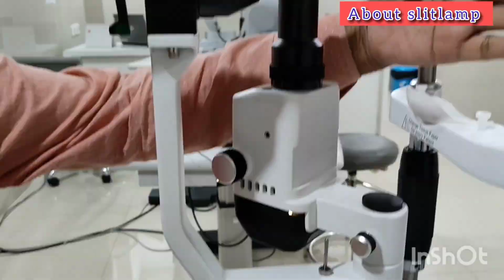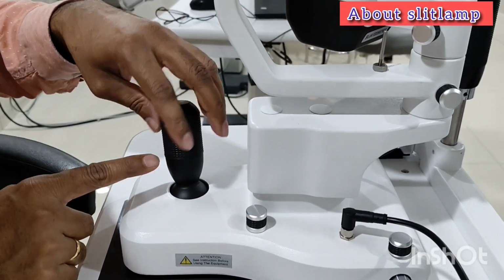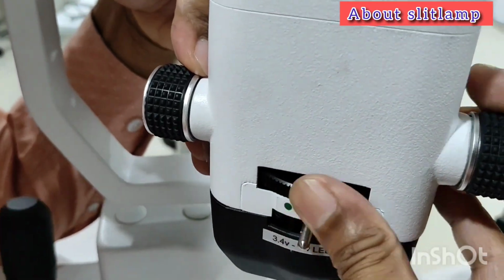Start the slit lamp with the main power knob. The joystick is used to move the slit lamp up, down, forward and backward. In the slit lamp, we have aperture ranging from 1 to 14.